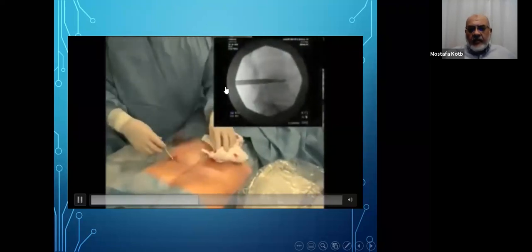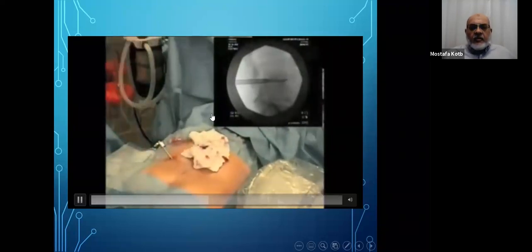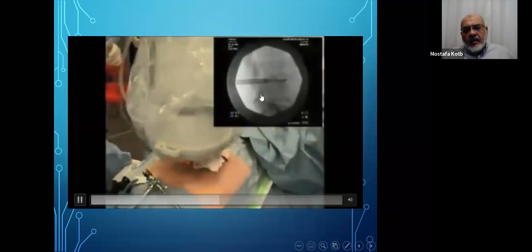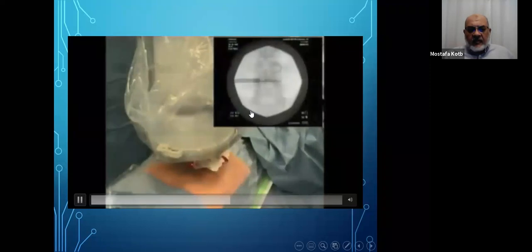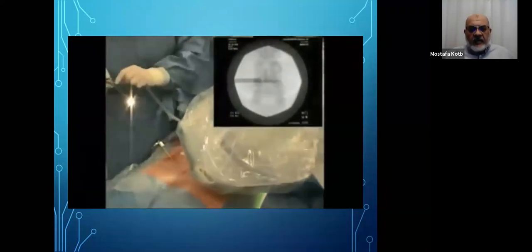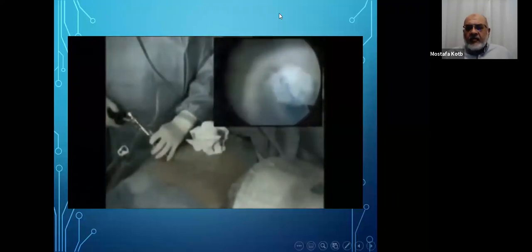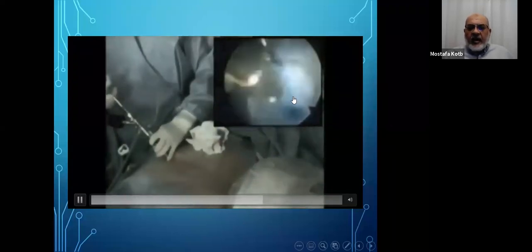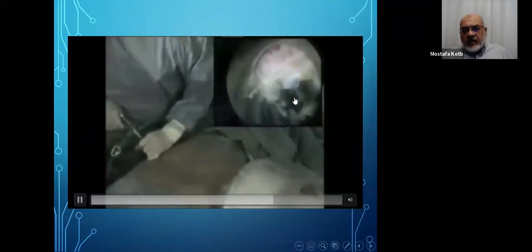After doing enough dilatation and removing the dilators and the guide wire, you introduce the endoscope, and then you go inside the disc. You don't go outside the disc. Here you go from inside the disc space, as you'll see in the next view. When you go by the endoscope, as you can see here, you're going inside the disc space and you start taking out the disc material from inside out.